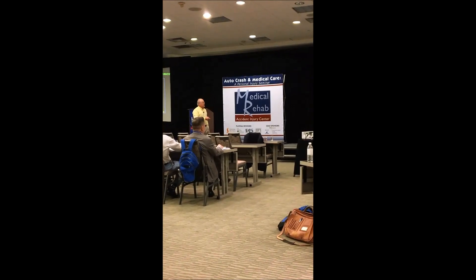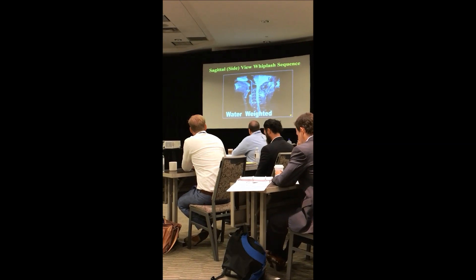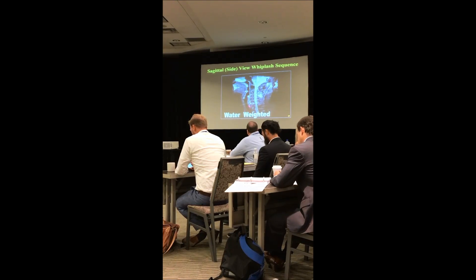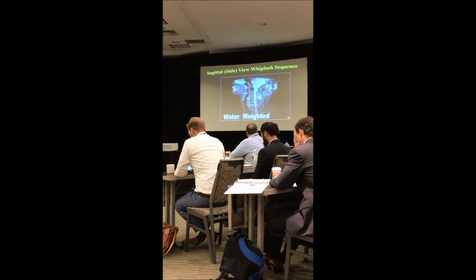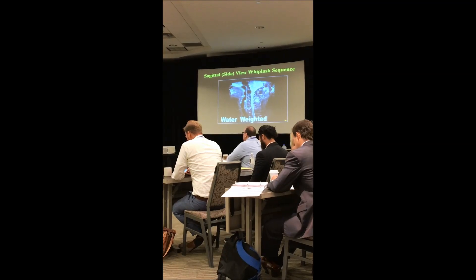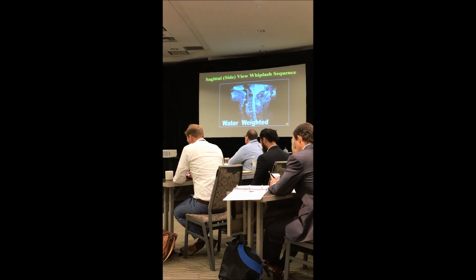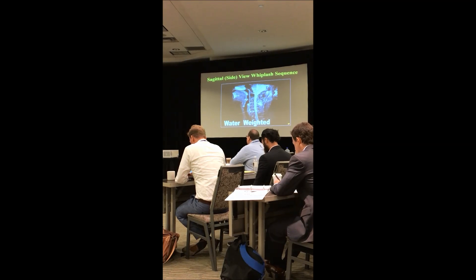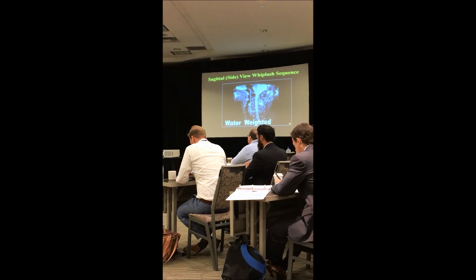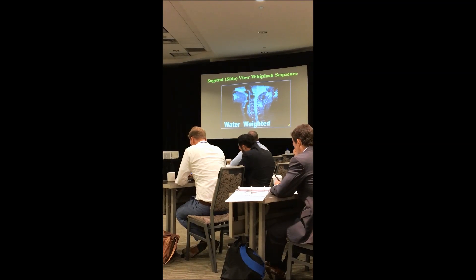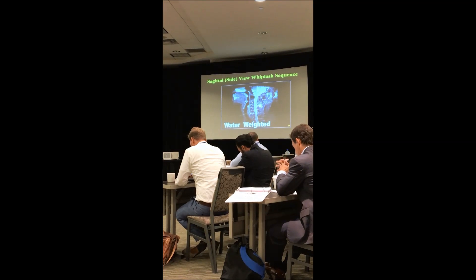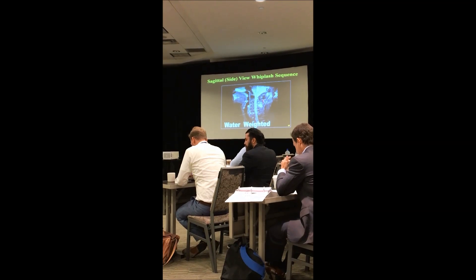Then we did a STIR sequence, which is basically eliminating everything — we just want to see water, eliminate everything else. That's a sequence we do with MRI. You can see how the fracture lights up even more than the T2 sequence. If you do a STIR sequence, we're going to see abnormal fluid much better than even on a T2 image. Clearly on T1 you don't see it. And that's another reason why some people may not mention an annular tear, a stress reaction, or a pars defect — they don't do that additional sequence we do on all of our scans. Here, off-midline, there's a lot more edema and signal in the paraspinous muscles and surrounding posterior soft tissues. Also, look what STIR shows: the patient tore the interspinous ligament — there's hemorrhage in the interspinous ligament. That should be a ligament — it's gone, with hemorrhage in there. So this is a fracture with hemorrhage, indicating an unstable spine.